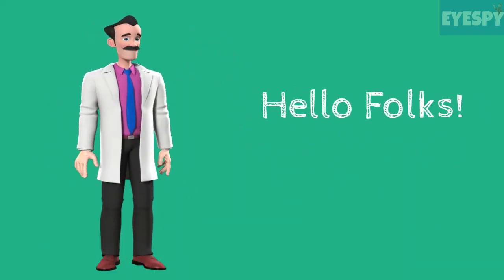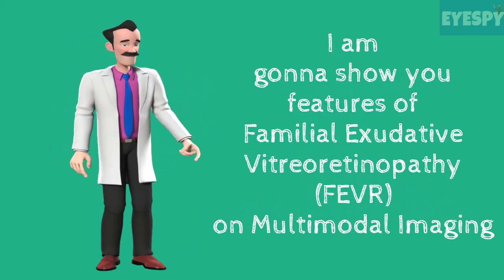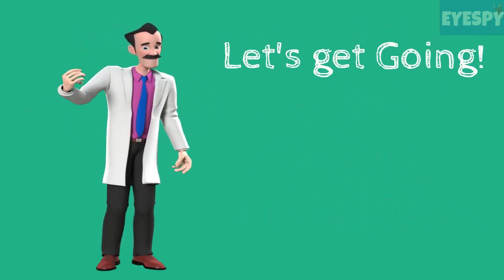Hi! Today I am going to show you features of FEVR on multimodal imaging. So let's get going!